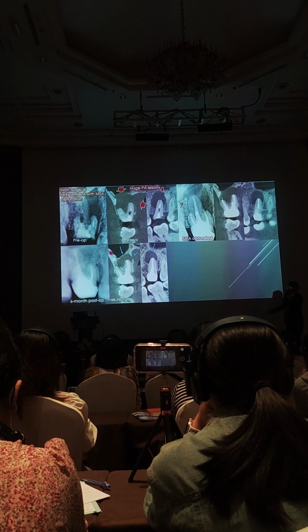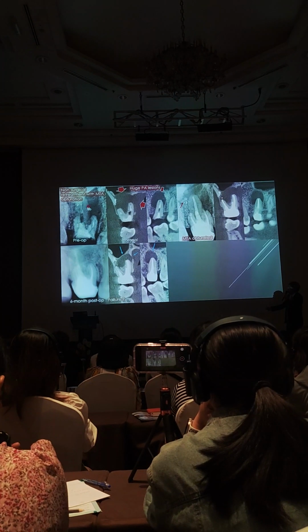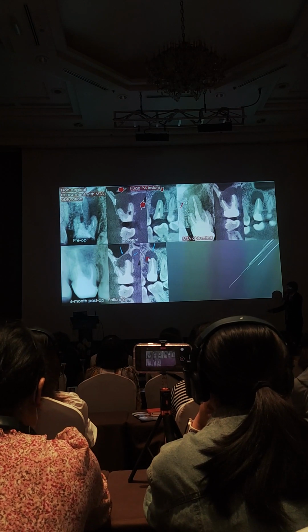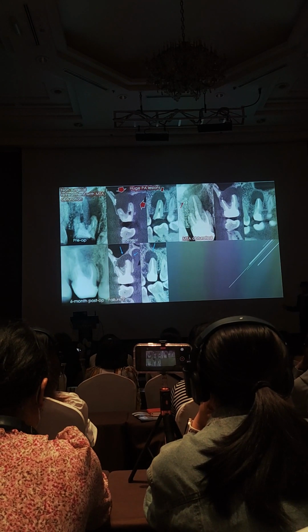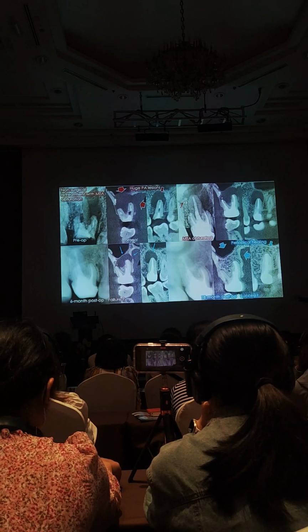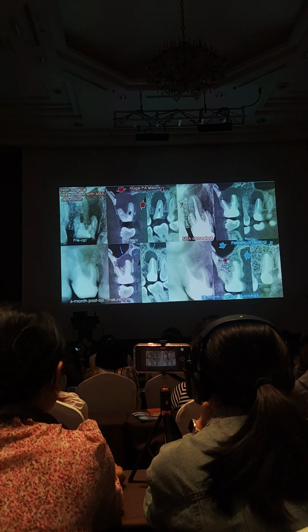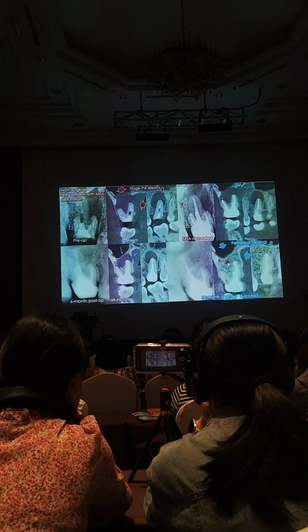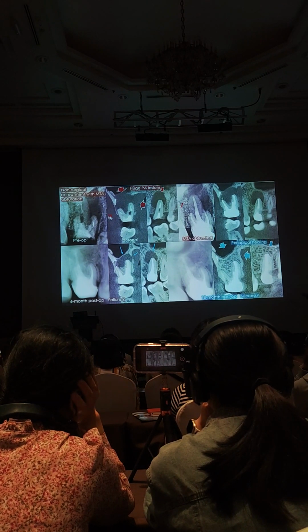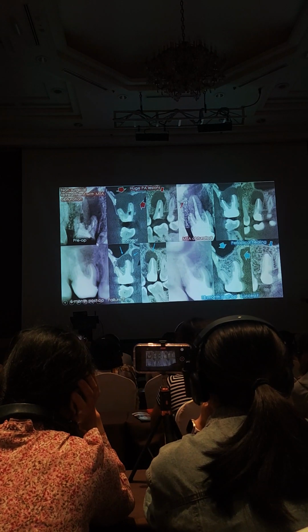Because comparing the size of the lesion with the preoperative lesion size, the lesion was completely smaller, I waited 18 months. Now look at the size of the lesion. No periapical lesions existing anymore. You see the complete periapical healing. Look at that. No periapical lesion at all.